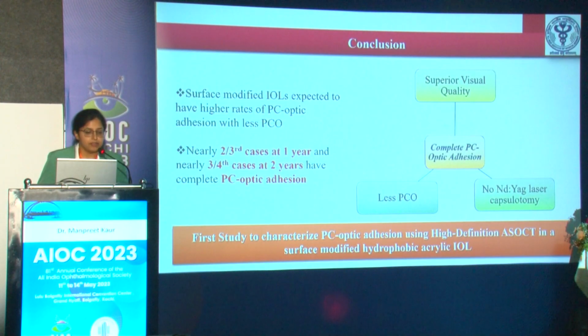So just to conclude, surface modified IOLs are expected to have higher rates of PC optic adhesion with less PCO. Nearly 2/3 of our cases at 1 year and nearly 3/4 of our cases at 2 years had complete PC optic adhesion. Complete PC optic adhesion is associated with a superior visual quality, less posterior capsular opacification, and no need for Nd:YAG laser capsulotomy. This was the first study to characterize PC optic adhesion using high definition ASOCT in a surface modified hydrophobic acrylic IOL and correlated with visual quality.